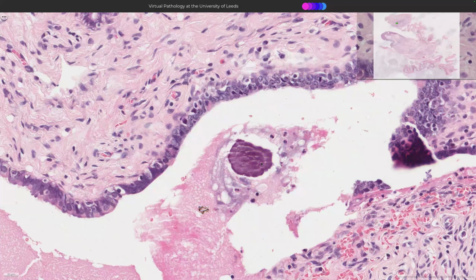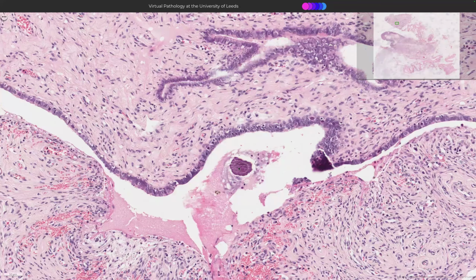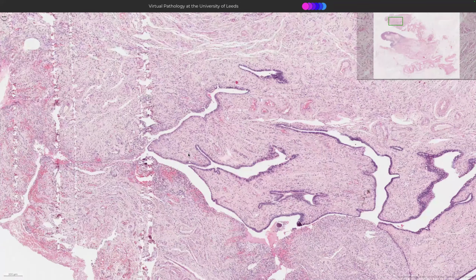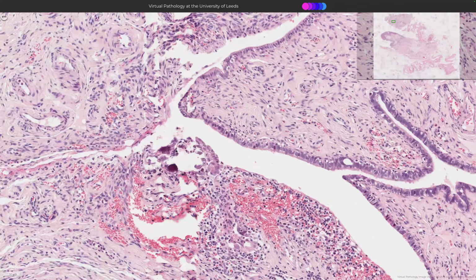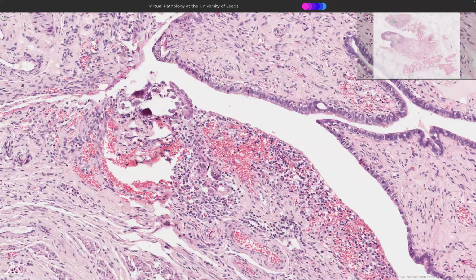Yeah, calc, yeah, it does have a kind of radial. So I was thinking a wee radial calc. I was wondering if it might have been actinomyces, just a tiny bit of it, but maybe not. I do prefer it for a calc. All right, so that's the fallopian tube. There's another one over here, another little calc. So calcifications in older women in the fallopian tube are expected. And this is like an infolding.